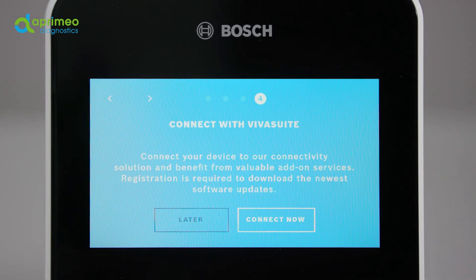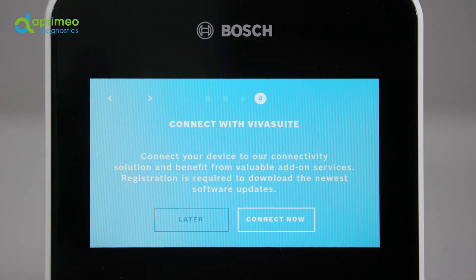You can connect your device to Bosch's own cloud solution called VivaSuite. This offers you many benefits in terms of device management. To learn more about the details, please contact one of our service representatives. But as for now, you may continue the setup process without taking a decision at this point.